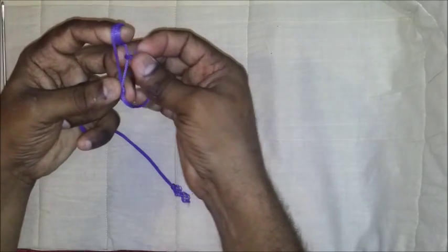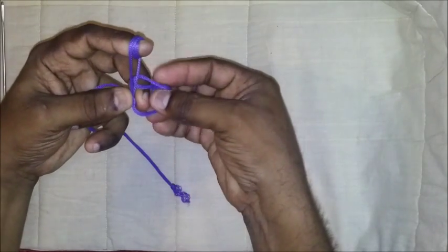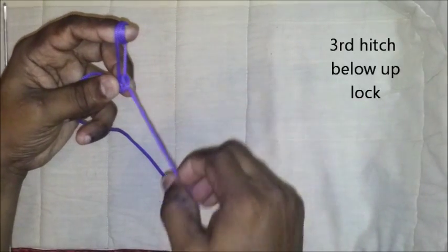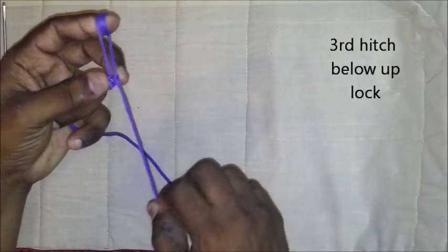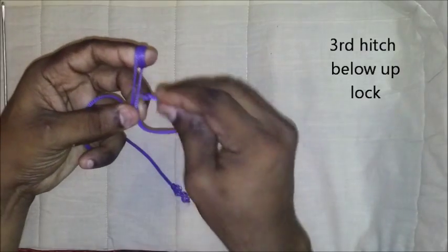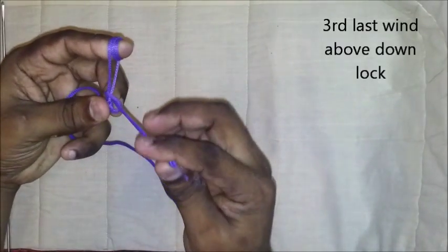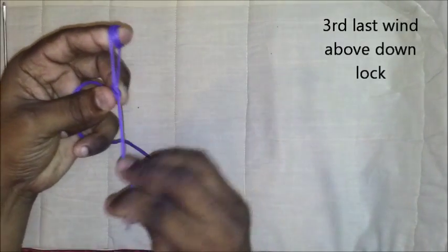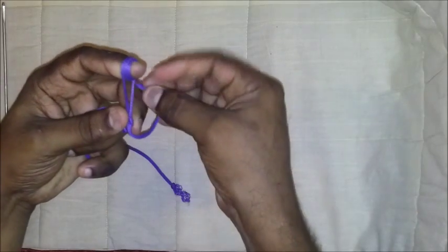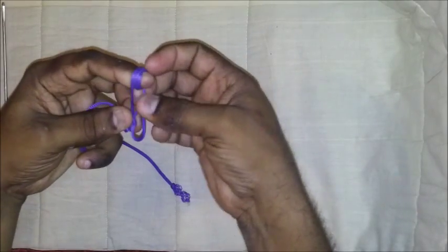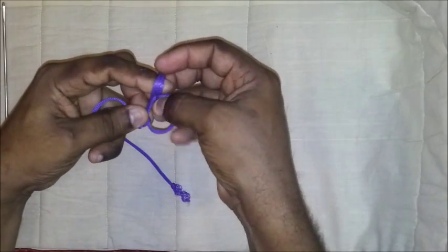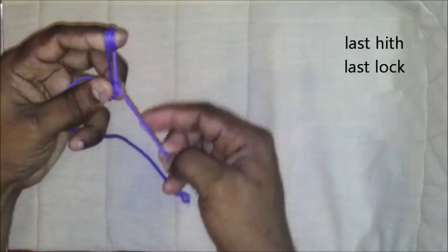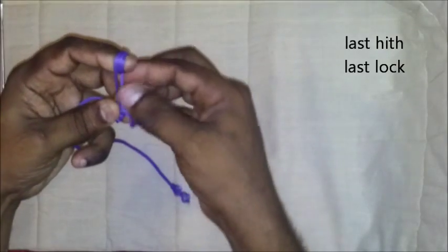A third hitch with lock and a third last wind with lock is taken over both. And the last hitch with lock is taken like this.